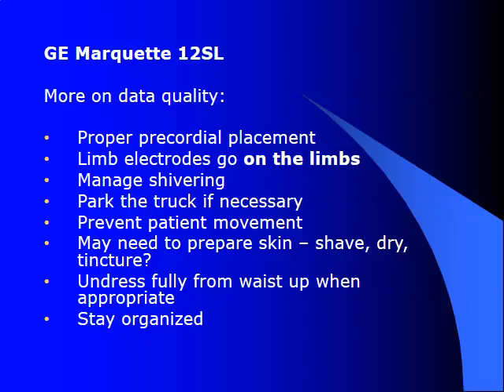Prepare the skin as you need to. Don't be lazy. If the chest needs shaved, shave the chest. Dry them. Using benzoin tincture is a very good way of getting those electrodes to stick on diaphoretic patients. Undress fully from the waist up and stay organized. Keep your electrode wires from touching each other and bouncing around, stuff like that. It's going to give you much better data quality.